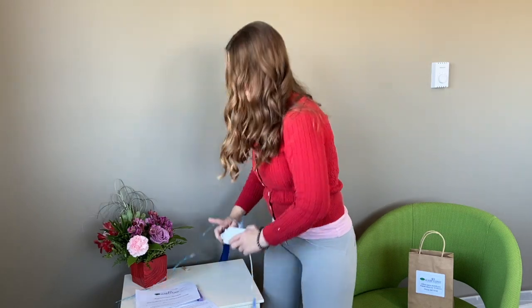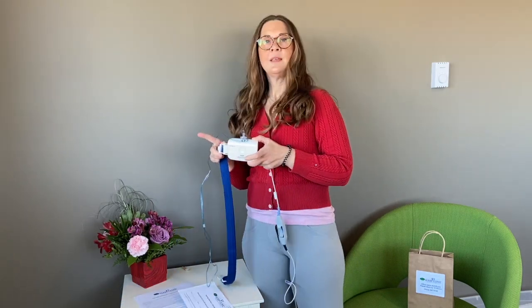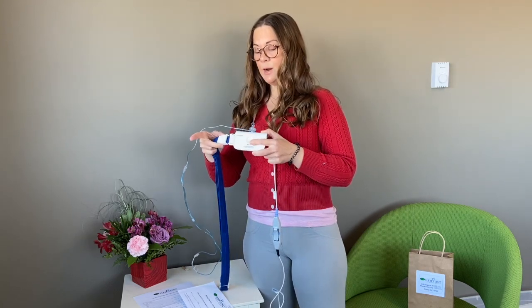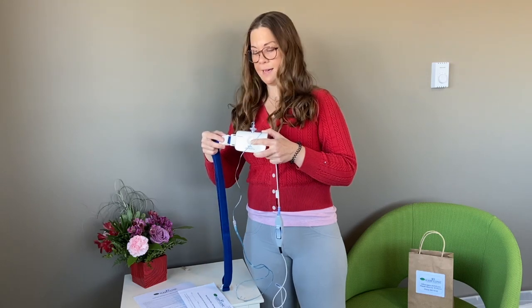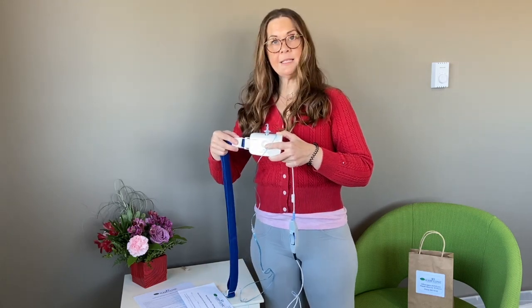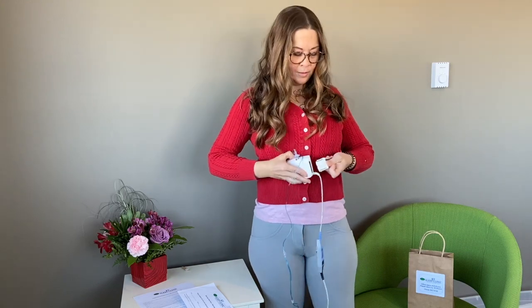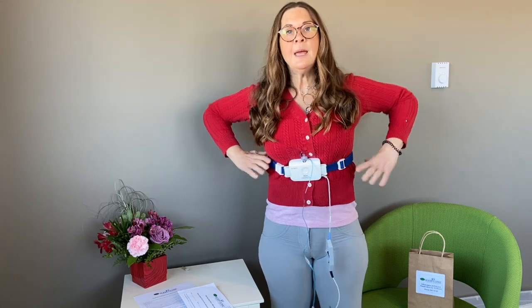I'm now going to show you how to put your sleep study device on. You're going to see it's a little box with a few things attached. It may arrive with the belt plugged into one side already. Place the little white box on the front, bring the belt around your body, and plug it into the other side. You will have to adjust the belt a little bit — you might want to do this before you plug it in, as it is adjustable. Make sure the belt is right around your rib cage.